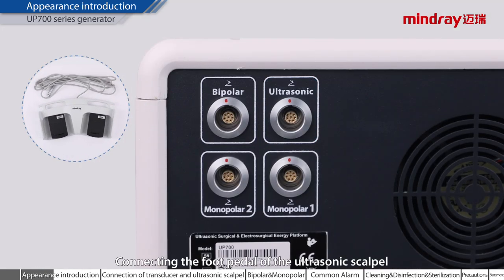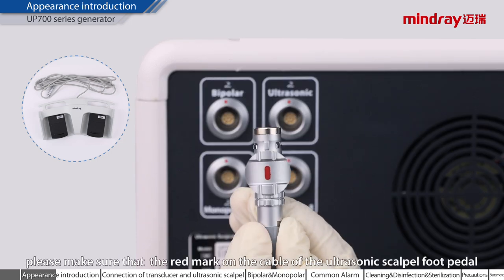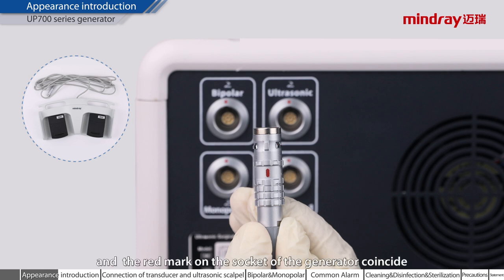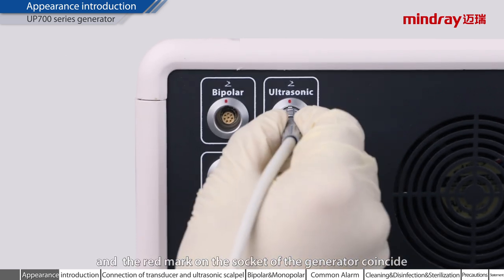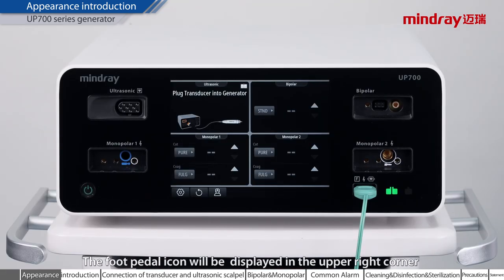Connecting the foot pedal of the ultrasonic scalpel. When connecting, please make sure that the red mark on the cable of the ultrasonic scalpel foot pedal and the red mark on the socket of the generator coincide. After correct insertion, the foot pedal icon will be displayed in the upper right corner of the ultrasonic scalpel function area. If you are not equipped with the foot pedal, the ultrasonic scalpel can be used normally with the handle button.